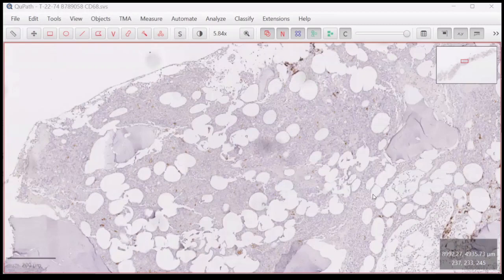But then the guide is you must first look at HNE, and preferably on the thinner section, and must observe the presence of atypical cells. That atypical cell, just to confirm that either they are myeloid or monocytic cells. The presence of those atypical cells must be first observed on HNE. Then you proceed to the stain.